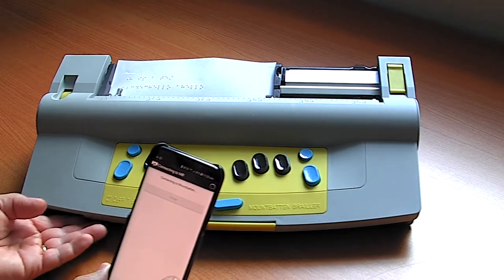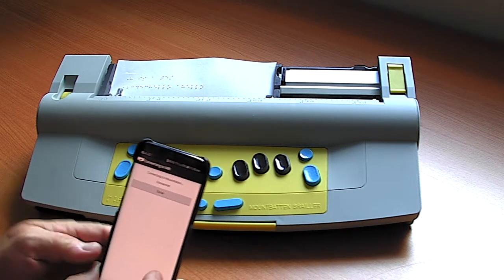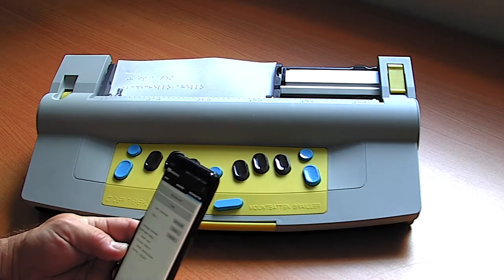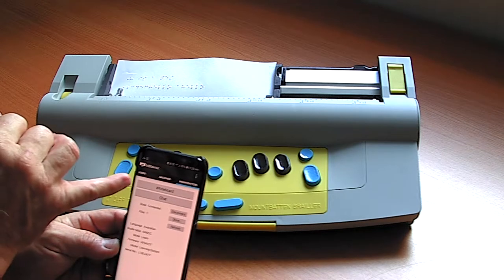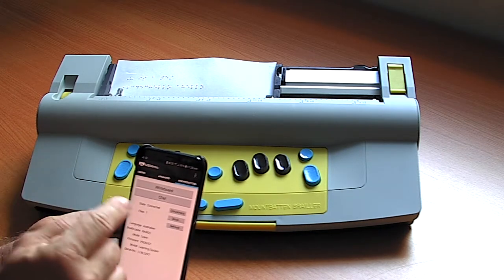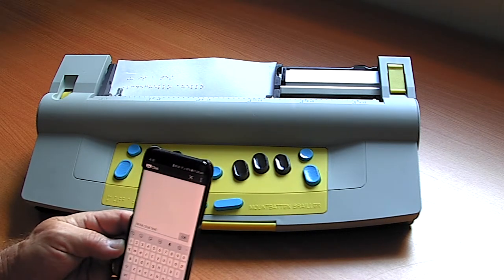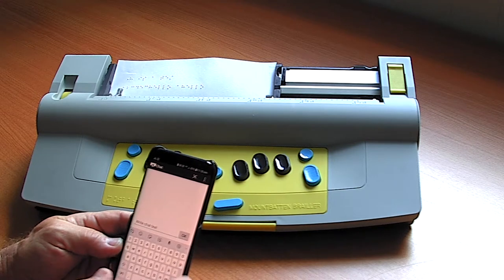I'll turn the volume up on the Mountbatten as it makes a couple of comments while connecting. When it's connected to my phone, I have a couple of options: I can choose a whiteboard or a chat session. I'm going to show the chat session first, because it's very similar to ordinary social media, making it familiar for parents and teacher aides without them actually knowing Braille.